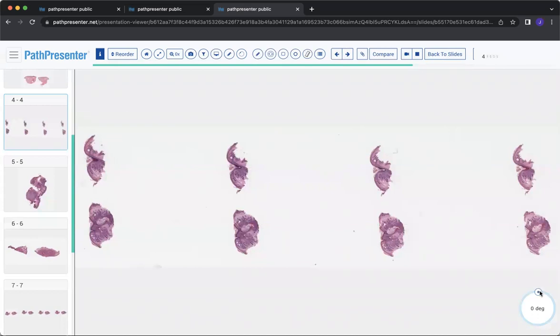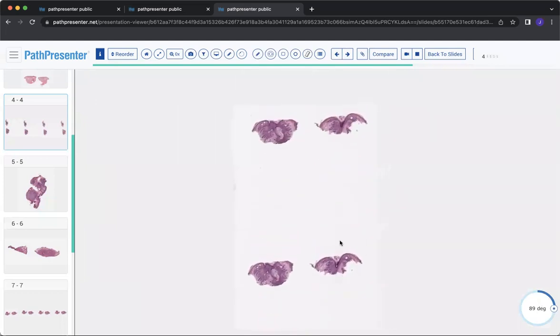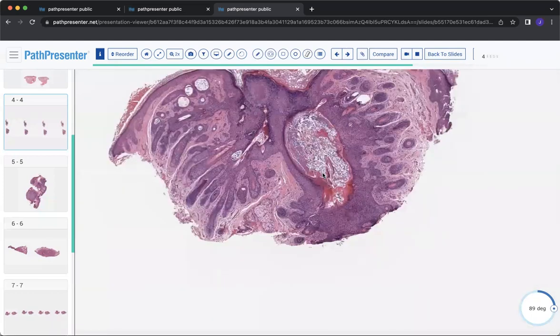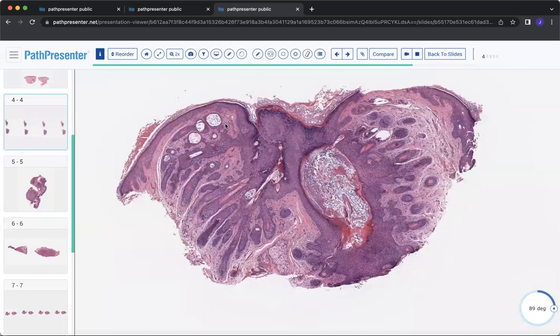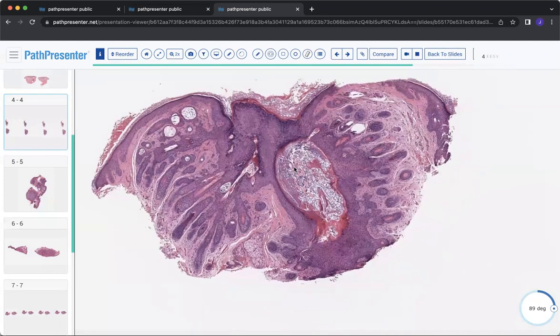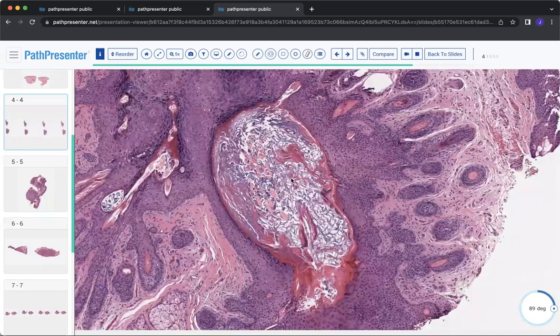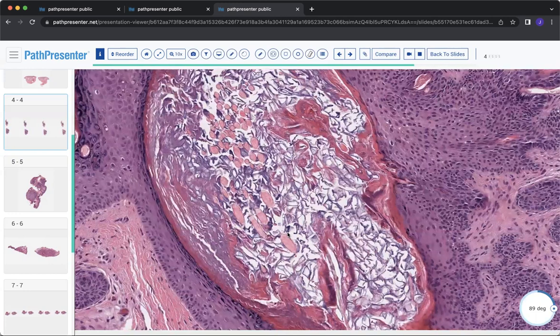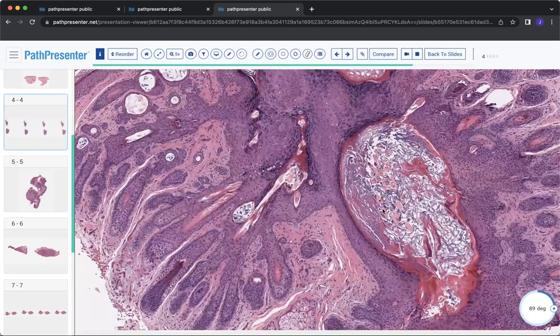Moving on, so you have 8 small little sections of tissue to look at here, and from low power, I think you can appreciate that they essentially show very similar things. So just choose one at random and start going into it. And what are you noticing right off the bat? You're noticing these small follicle-like structures radiating from a large central pore. You see that? And then within this large central pore, you've got numerous hair shafts all collecting together. So people have likened this to daughter follicles leading into a mother follicle.